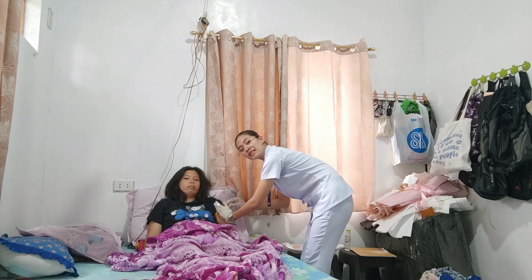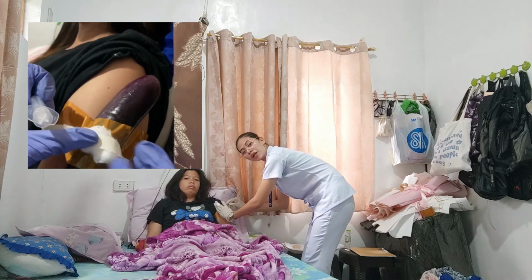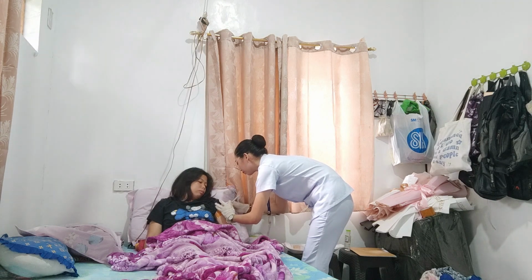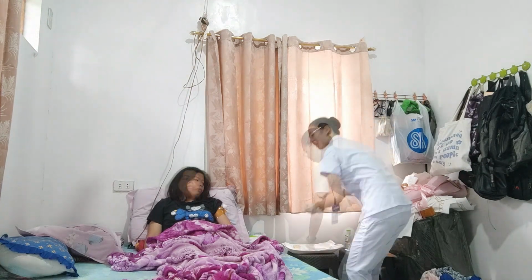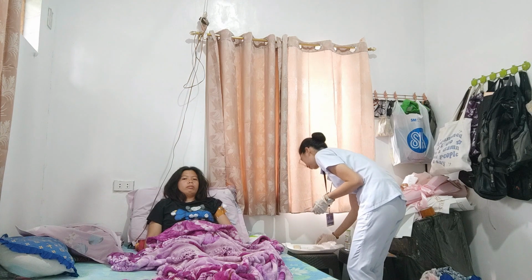Now, quickly withdraw the needle and place a swab or a gauze on the site. Apply gentle pressure and do not massage the area. After administering the medication, make sure to dispose the supplies appropriately to avoid accidents and flip down medication ticket. Then we're going to place the patient in a comfortable position and discard our gloves and perform hand hygiene.